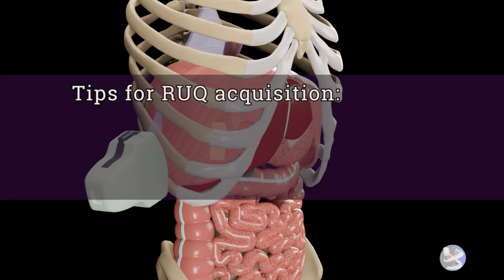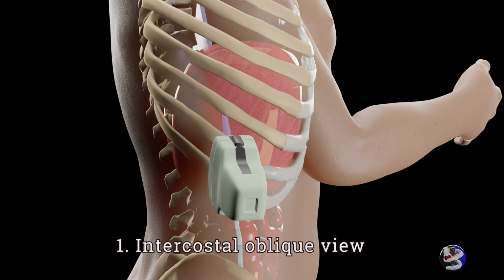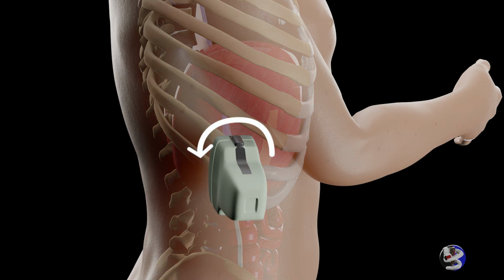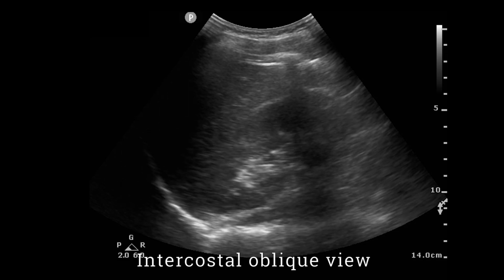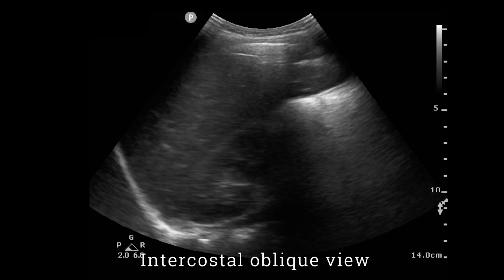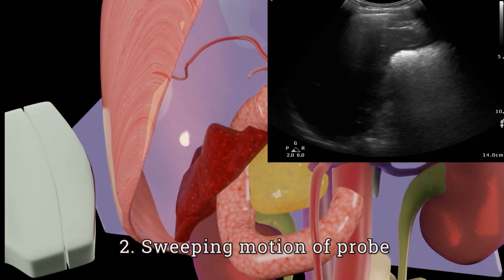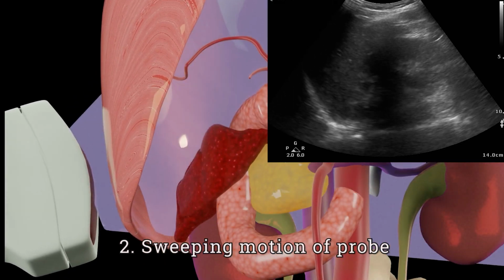Some tips for right upper quadrant assessment include the following. If the rib shadows are prominent, the probe can be rotated counterclockwise, with the probe marker pointed towards the posterior axilla in what is known as the intercostal oblique view. This causes the footprint of the probe to be parallel to that of the ribs. The sweeping motion increases the sensitivity to detect free fluid.